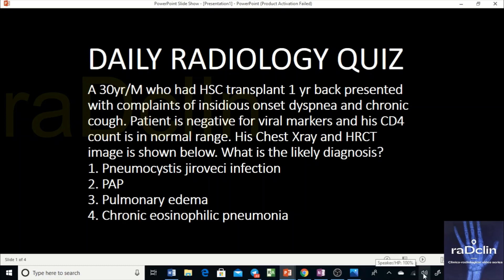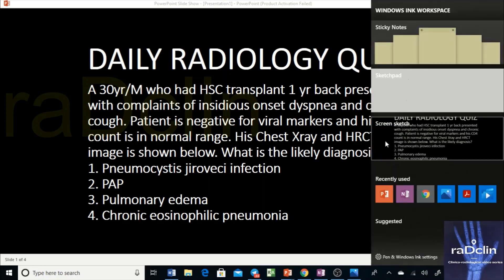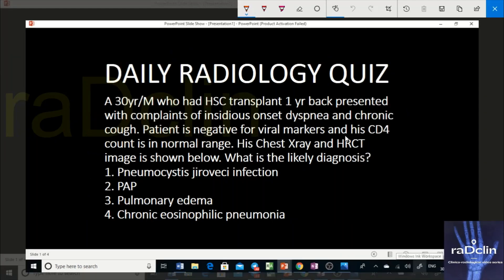When we read topics from a book, we miss out on differentials, and when the patient comes we are confused about what exactly the diagnosis is, because the patterns on CT or X-ray are so overlapping. You have to pick objective findings to differentiate, and this initiative addresses that issue. Now, in this particular question: there is a 30-year-old male who had a hematopoietic stem cell transplant one year back, presenting with complaints of insidious onset dyspnea and chronic cough. The patient is negative for viral markers and his CD4 count is in the normal range. Chest X-ray and HRCT images are shown. What is the likely diagnosis?